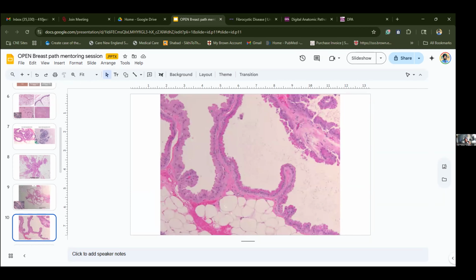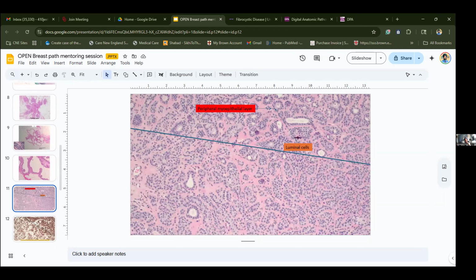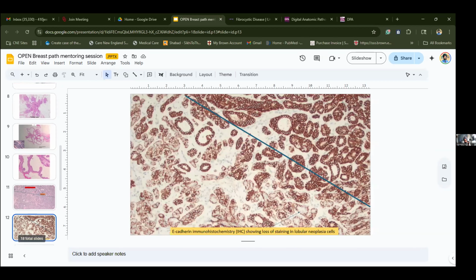So paying attention to the histology, but also asking the questions that are kind of in the background. Why are these clustered? You will notice subtle things once you have gone through the middle or you're at the end. Things like adenosis, and then adenosis involved by this. So there's a little subtle difference between the top and the bottom portion of this proliferation, and you can only pick it up by using immunohistochemistry. So the E-cadherin immunohistochemistry shows that in the bottom part, there is a loss.